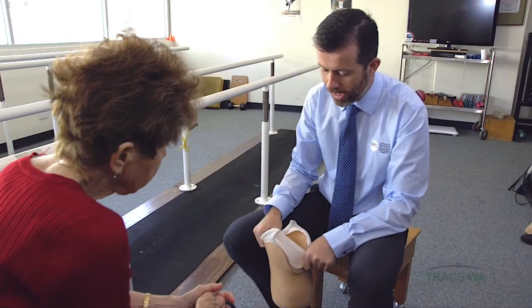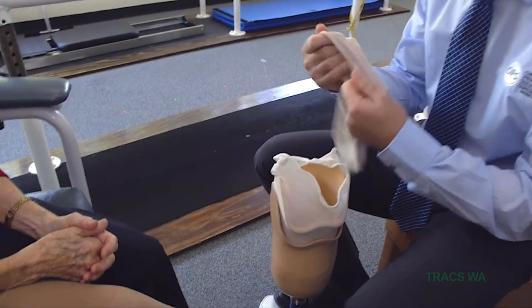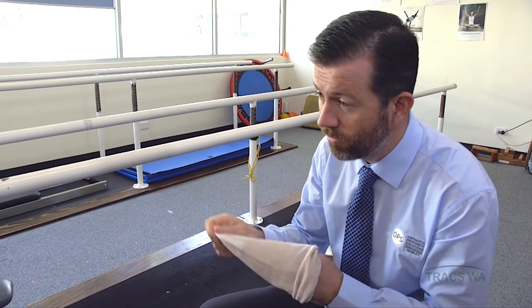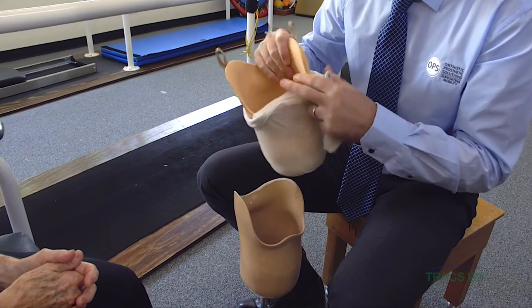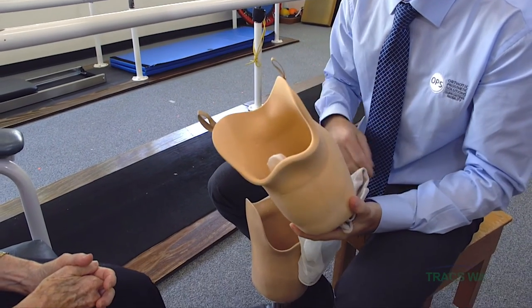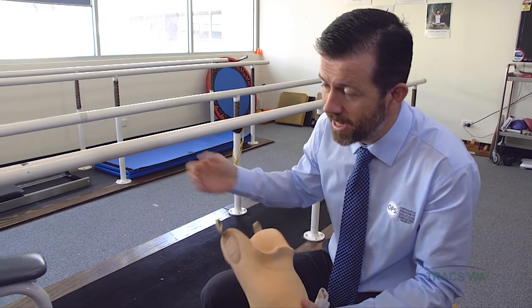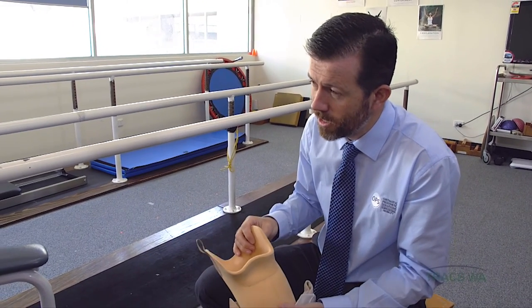It's really important to keep a prosthesis nice and clean. The cotton socks you wear inside the prosthesis, just like regular socks, should be worn for the day and then washed. The liner and socket can be wiped with a warm soapy cloth — if not daily, then pretty regularly. As you wear the prosthesis for most of the day, it will get warm and sweaty, so it's a good idea to give it a wipe out at the end of each day.